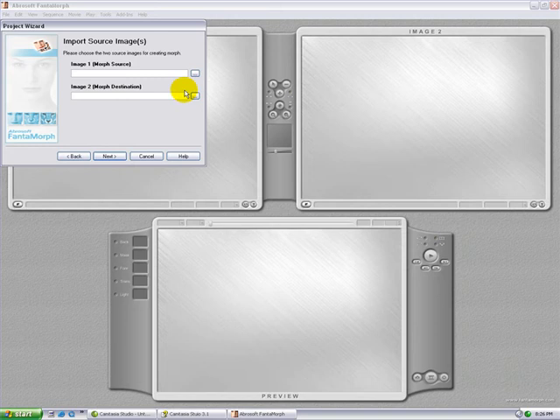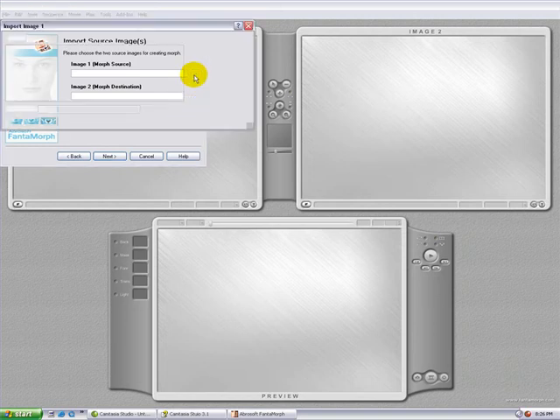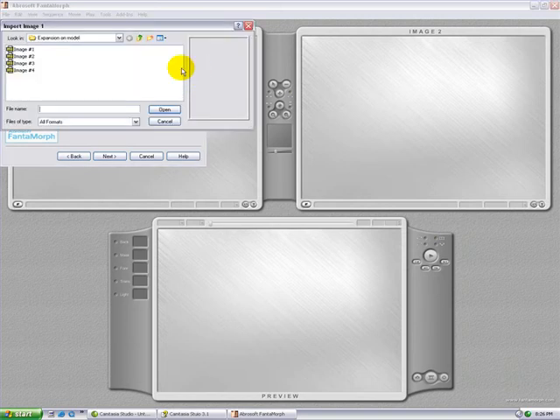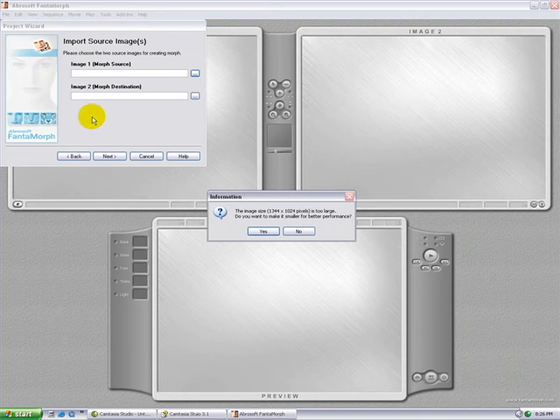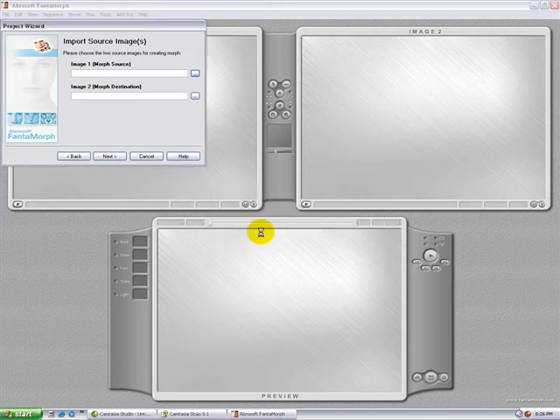We're going to import the images for this project. Click on image number 1. Choose the thumbnails and click on image number 1. Click yes to minimize the size.